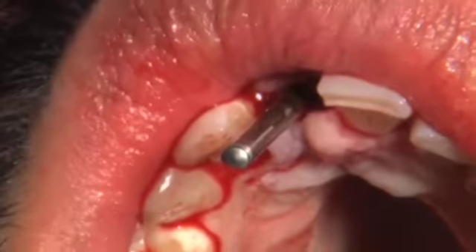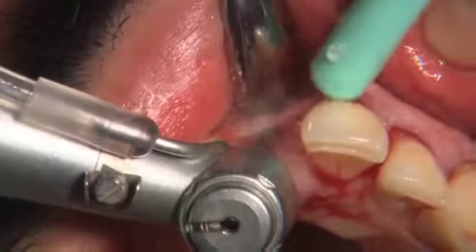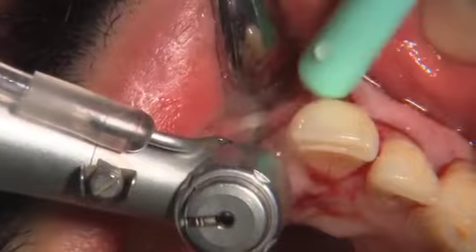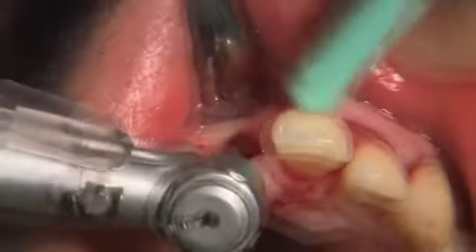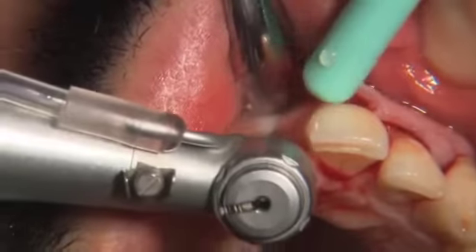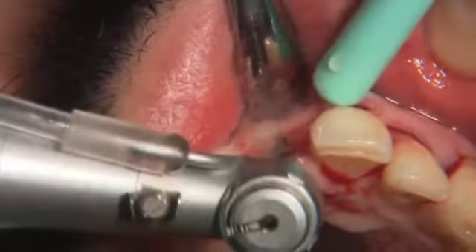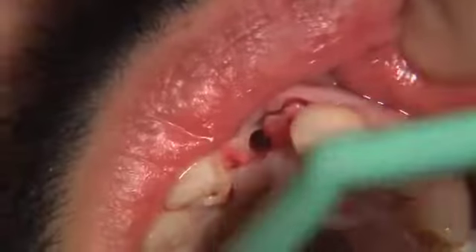And once our initial 2.3 drill has been completed, it's placed and a periapical radiograph taken to verify the location and position before the 2.8 final drill osteotomy portion is completed. Care, of course, must be taken to reflect the tissue both palatally and buccally to ensure no iatrogenic damage from the drill during the osteotomy process.